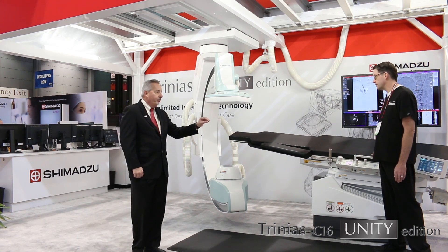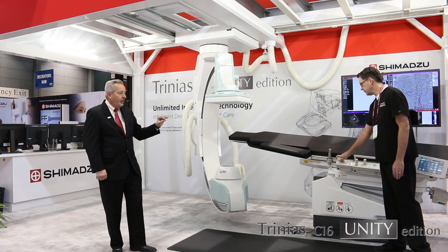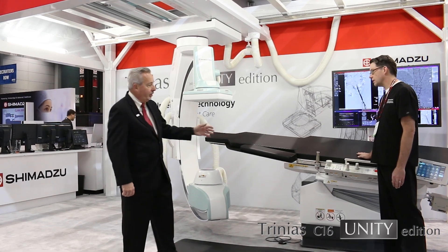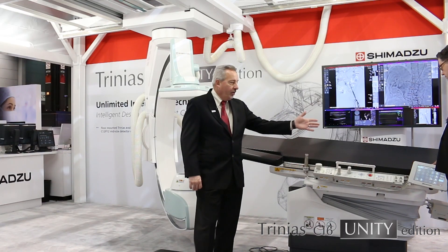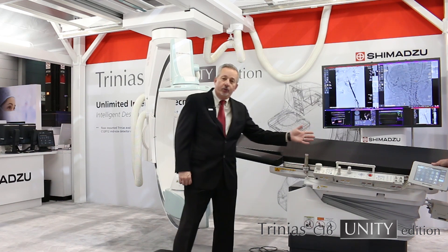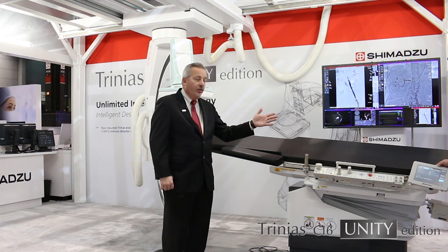You can see that it's a free float table in all directions, and all the table side controls are easily accessible right at the side of the table. You have imaging controls, C-arm controls, and processing controls, all the way down to the Smart Touch at the table side, which controls a number of functions for acquisition and display.